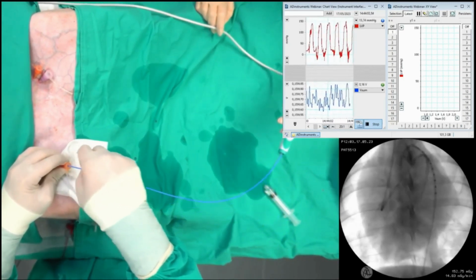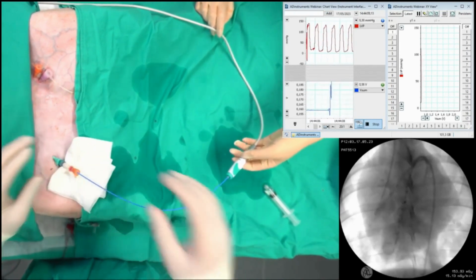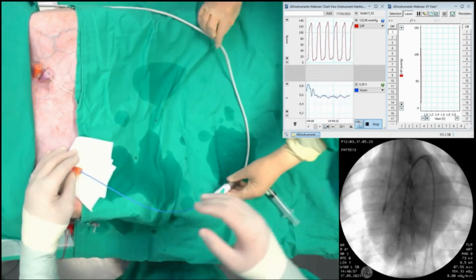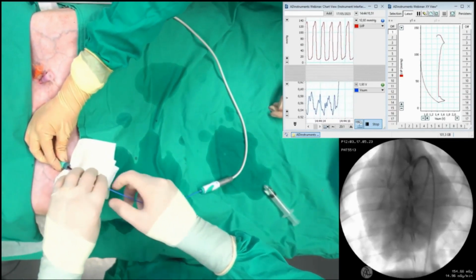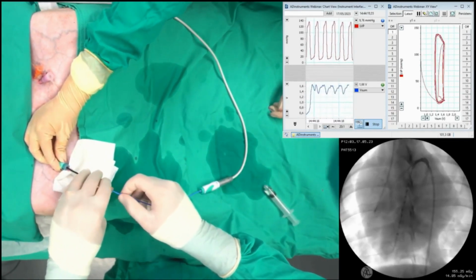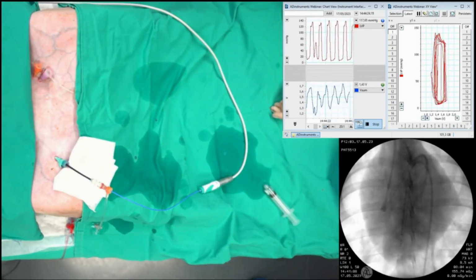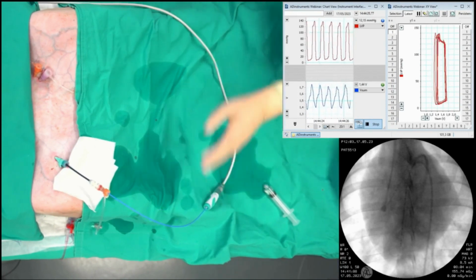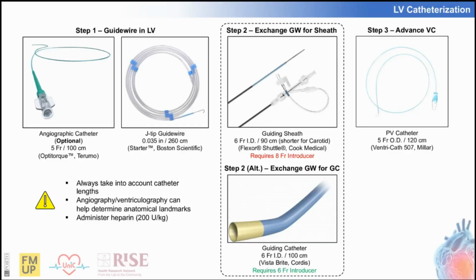And you see here the volume segments of the ventricath coming up the sheath, and then you see the pigtail of the ventricath inside the LV, pointing towards its apex and nicely aligned with the long axis. Then we pull the sheath out. You see its tip coming out and releasing, in quotes, all of the segments of the ventricath, and then you have your loops. Then you check your different segments and make sure that you are in the correct position. And if you need to adjust anything, you can do it now.